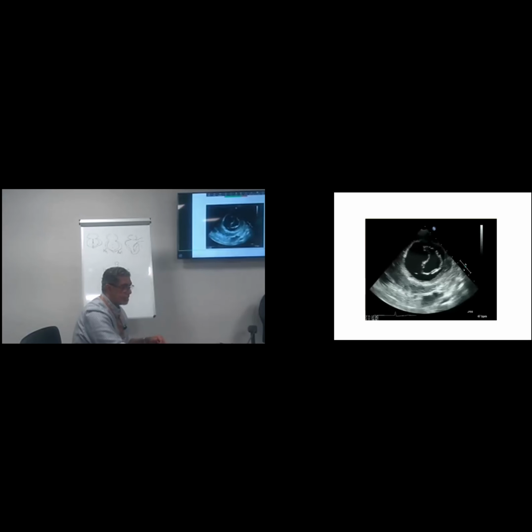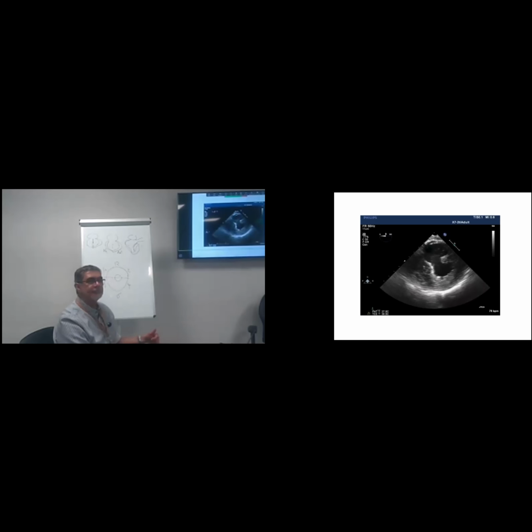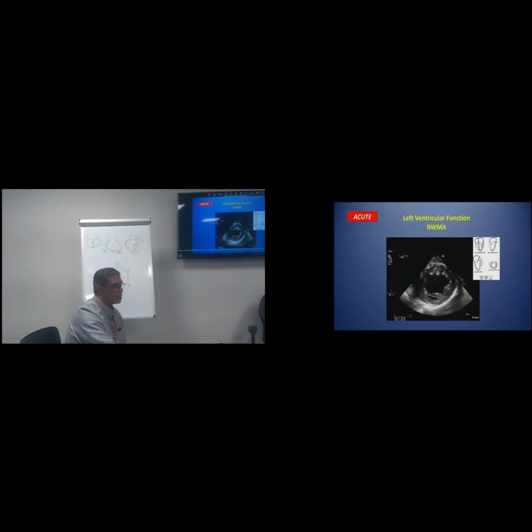Yes, excellent. Yes, 8 o'clock. Acute LAD.